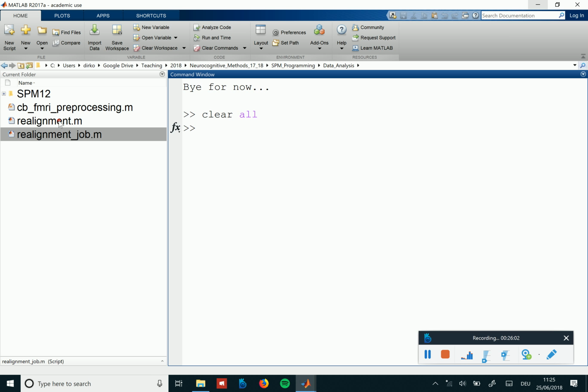So as I said previously, there's a whole research field that is called computational anatomy, and whatever we do in this realignment, spatial pre-processing and so on, there's a lot of theory behind this. So this is not trivial. I'm just not going into the details of everything there because lifetime is limited.